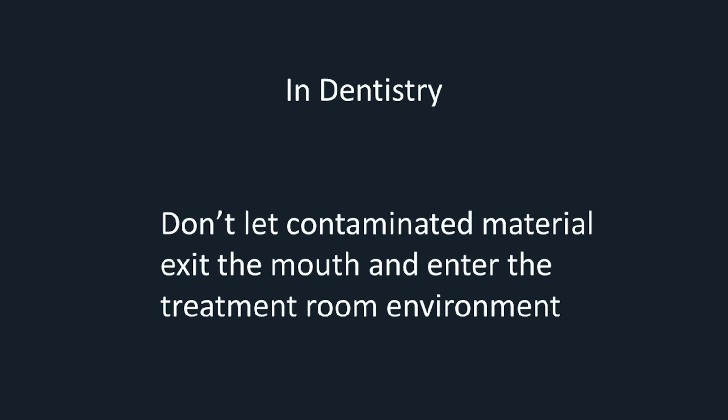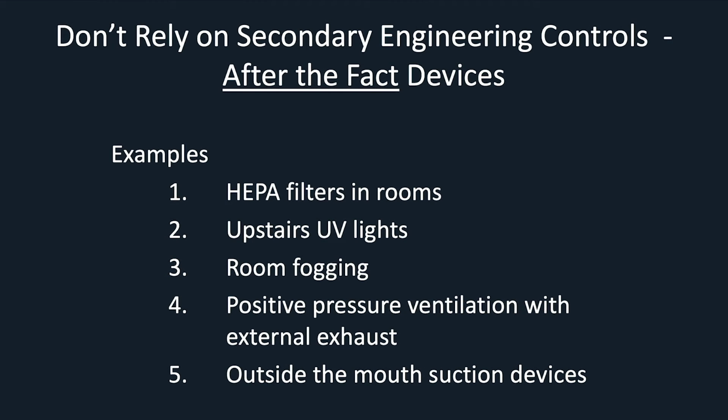In dentistry, that means don't let the contaminated material exit the mouth and enter the treatment room environment. And that also means don't depend on secondary engineering controls or after-the-fact devices. That would be HEPA filters, upstairs UV lights, room fogging, positive pressure ventilation, and outside-the-mouth suction devices.